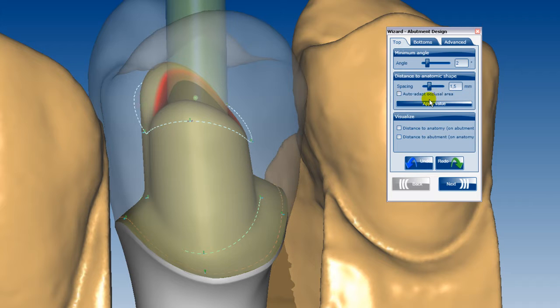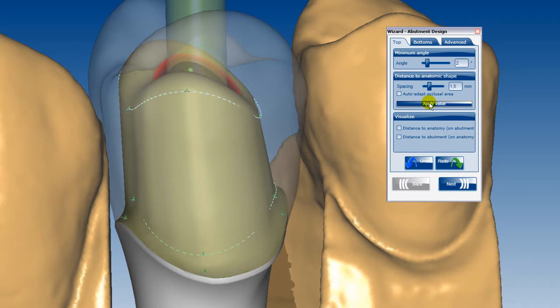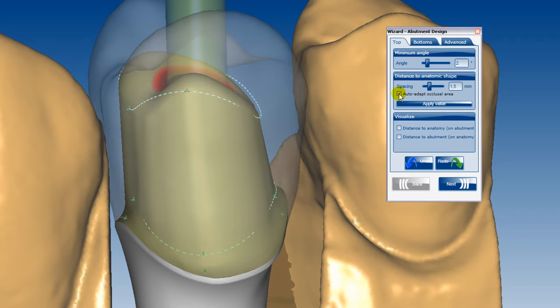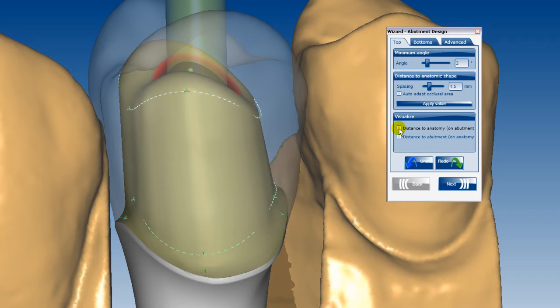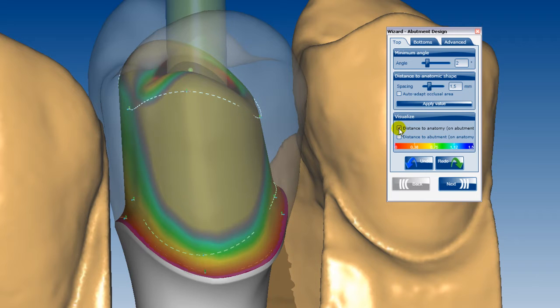The shape of the upper section of the abutment adapts to the chewing surface by ticking 'Adapt to Occlusal Area'. The distance between the abutment and anatomical shape can be shown in colour by activating the tick box in the wizard.